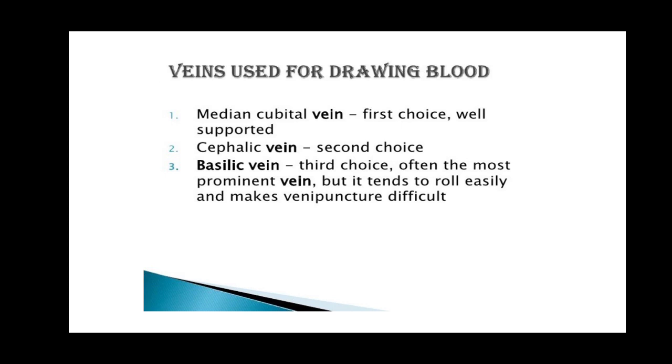So here the veins used for drawing blood are the median cubital vein, that's the first choice and well supported. If we look across the median cubital vein, the second choice will be the cephalic vein and the third the basilic vein.